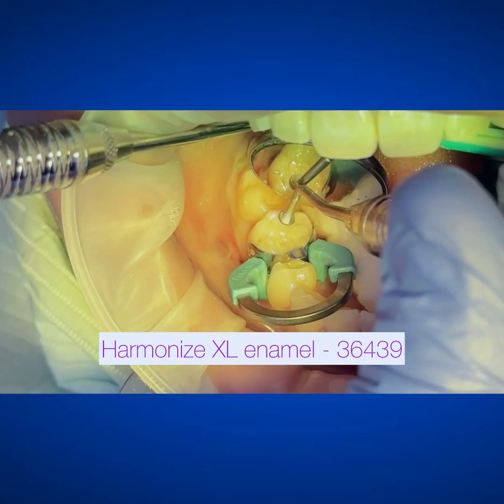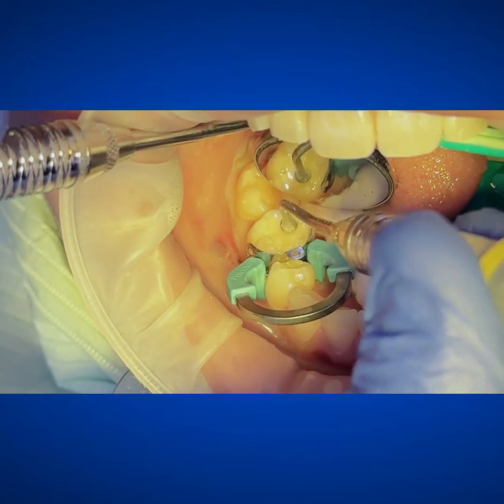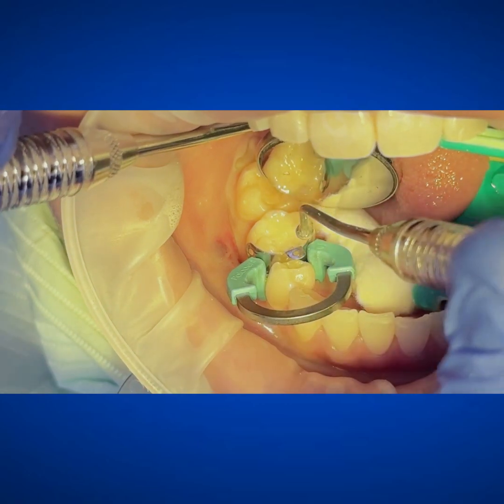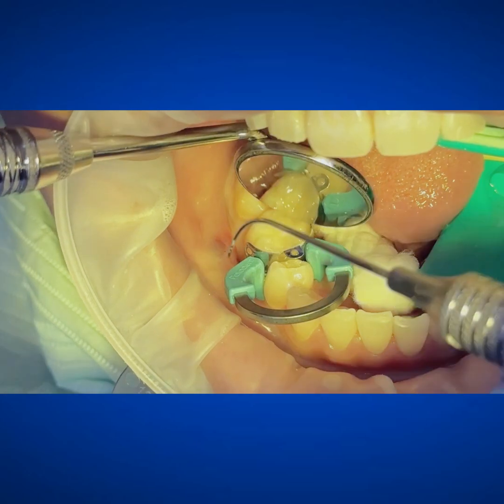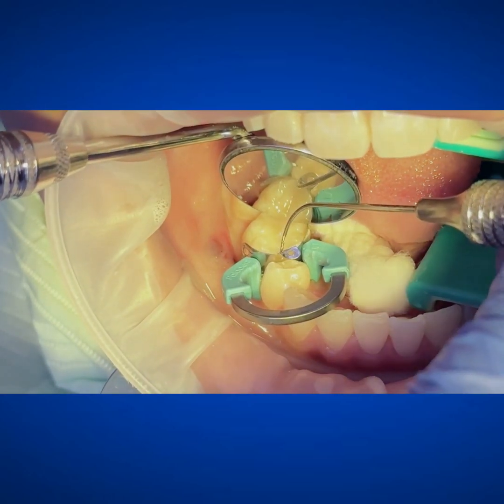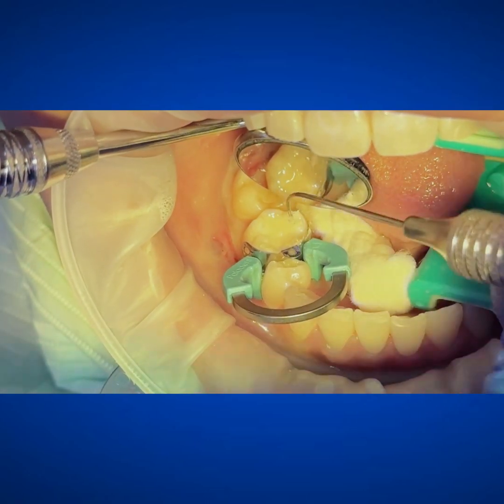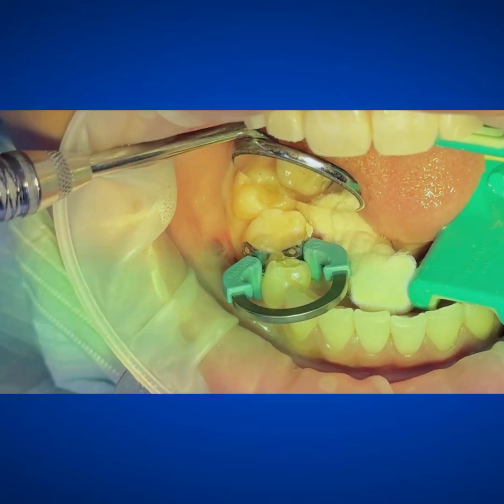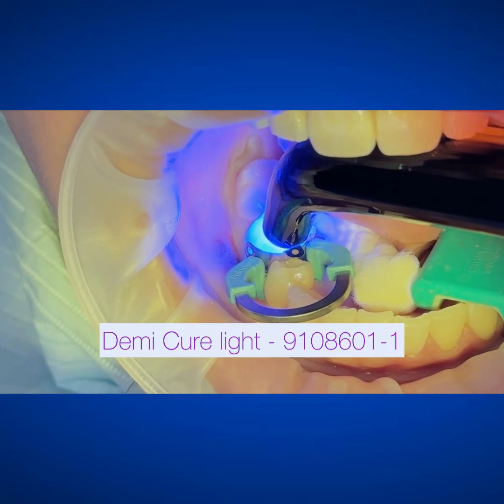If you wanted to go Sonic Fill for the whole thing, you can. Just do whatever works well for you. I'm using an acorn condenser because I like how it pre-shapes my occlusal anatomy, and then you'll see later that there's a matching bur called the Raptor. I'll get in there with my explorer and shape that marginal ridge. Do whatever is comfortable for you — just know that all these materials are fantastic.